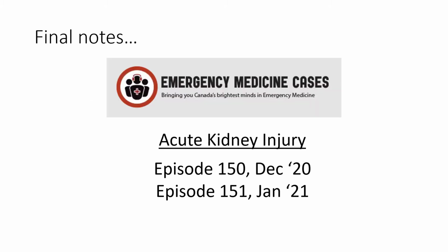I am sure many of you listen to EM Cases. There were 2 episodes on acute kidney injury a few months ago. POCUS came up more than once, especially with respect to ruling out a post-renal cause of kidney failure. And guess what? The most important finding there is the one we discussed today, hydronephrosis, usually bilateral, so you can check that out.